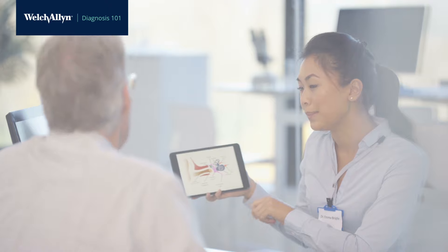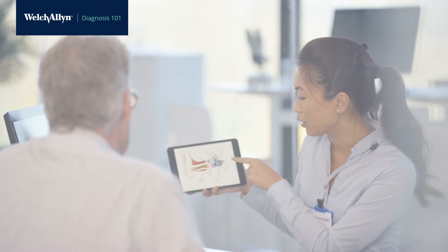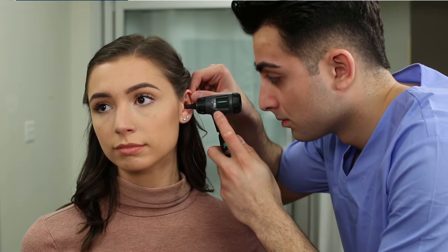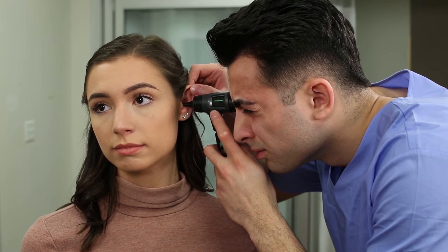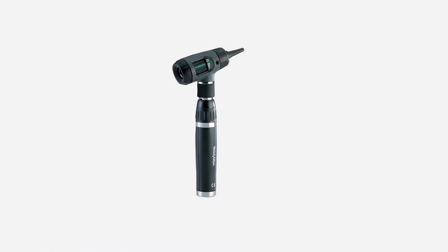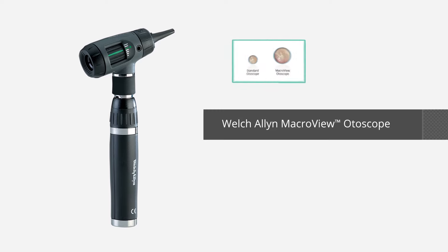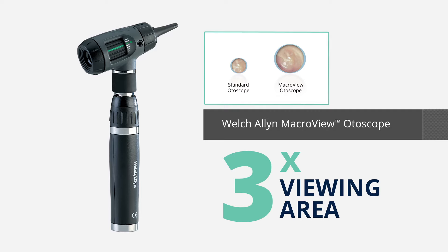Examining the ear is one of the primary methods used for diagnosing patient complaints for the entire ear nose throat complex. The otoscope helps you view the ear canal and the tympanic membrane with clarity. The basic steps are the same for any otoscope, but we'll be showing you how to use our Welch Allen macro view otoscope, which allows you to see three times the area of the ear canal and tympanic membrane than a traditional scope in a single view.